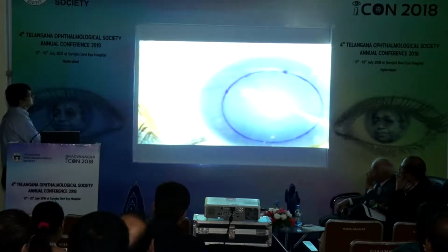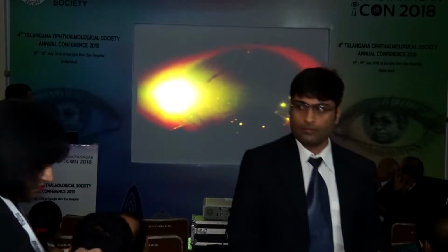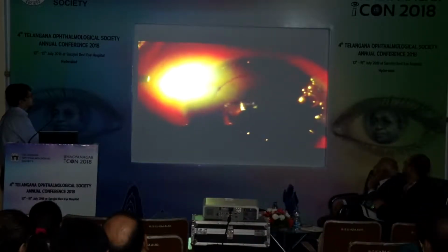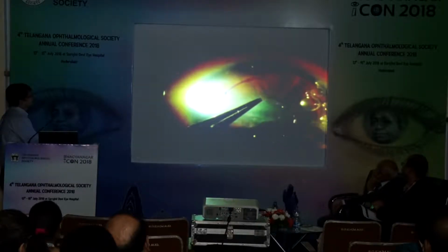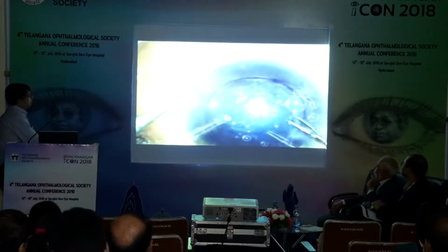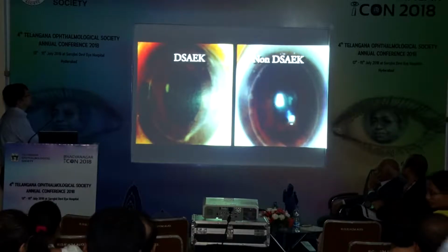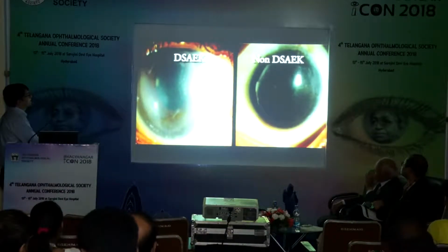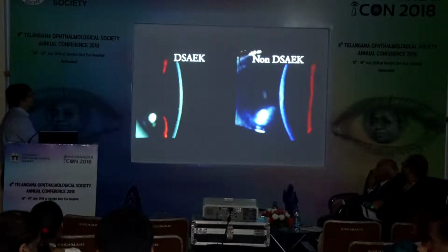In addition, the thick Descemet endothelial complex further compounds the DM stripping, and the inadvertent pull of the stromal fibers results in poor interface, thus directly influencing the final stromal clarity. All these difficulties necessitated modification in the surgical steps. We have successfully shown that Descemet stripping is an avoidable step while performing endothelial keratoplasty, provided the Descemet endothelial complex is optically clear, free from guttae, pigments and scars.